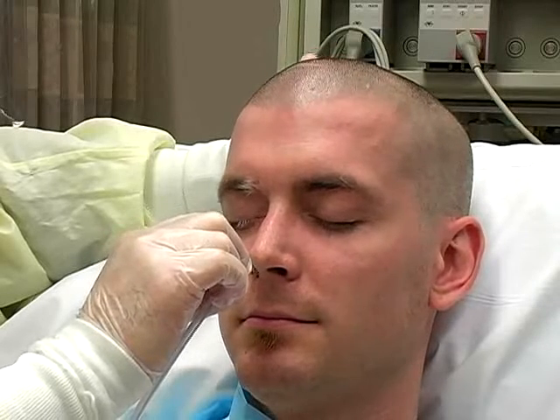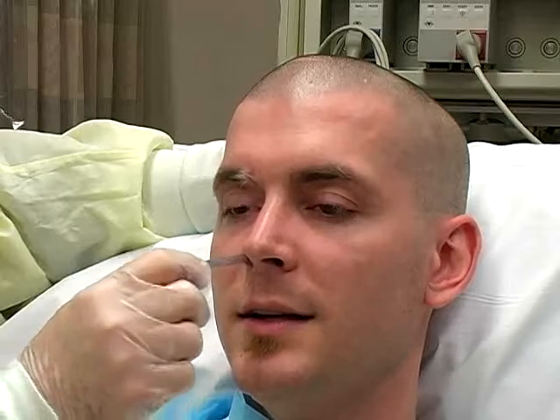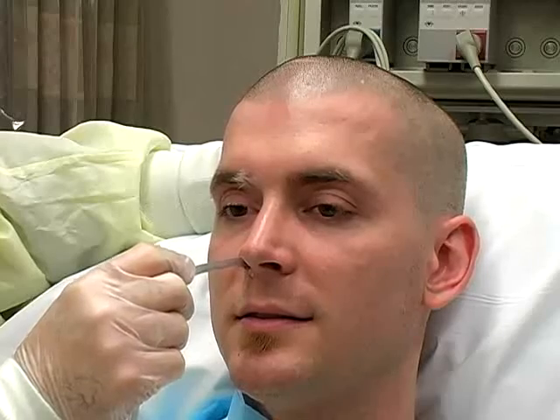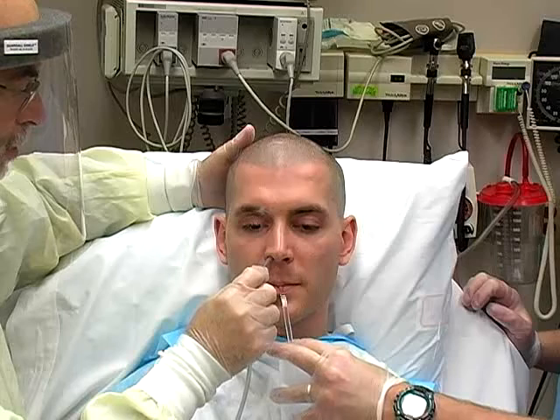Continue to advance the tube until it rests just above the larynx, which may be indicated by patient gagging or by a palpable resistance felt through the tube. Now you are ready to advance the tube into the esophagus. Enlist the help of an assistant to hold a cup of water with a straw for the patient.